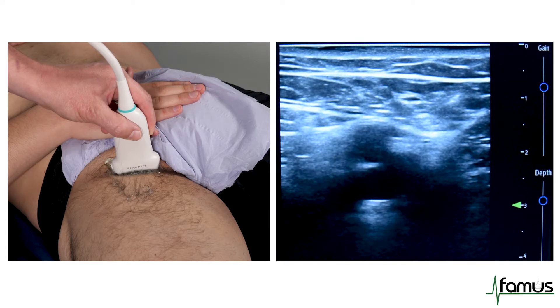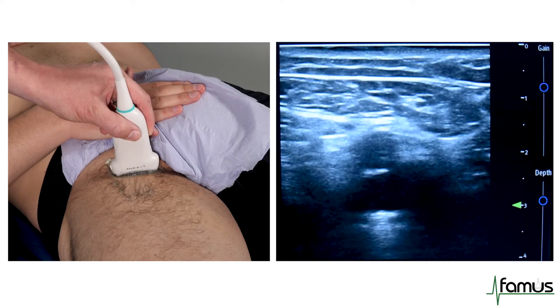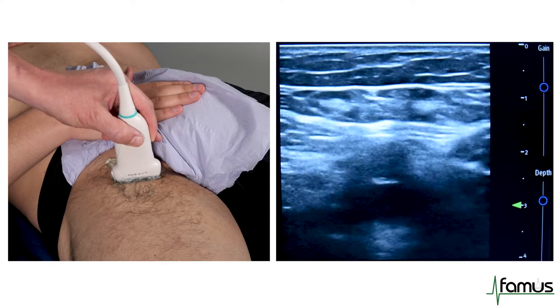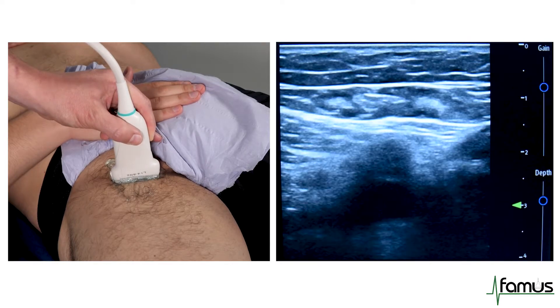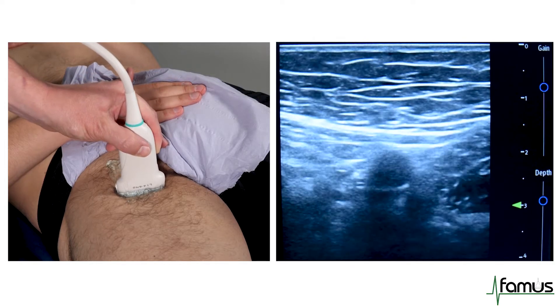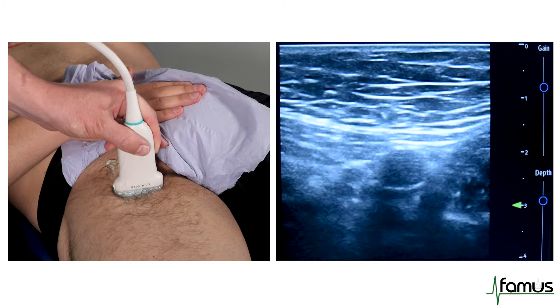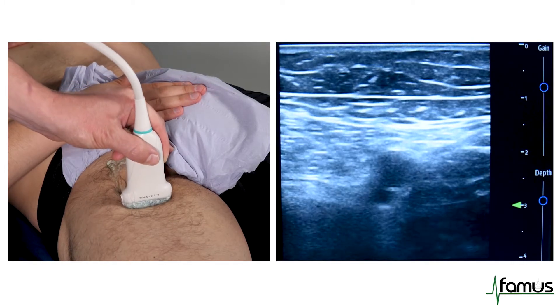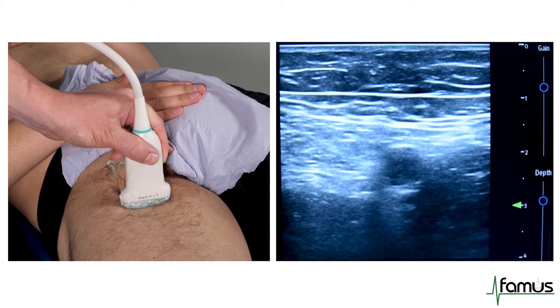We then encourage you to slowly follow the path of the femoral artery and femoral vein down the leg, compressing every couple of centimetres, just to ensure that the vein remains patent. Although the FAMUS scan is a three-point scan only, so this isn't mandatory. We then move on to our next point, which is in the middle of the thigh.